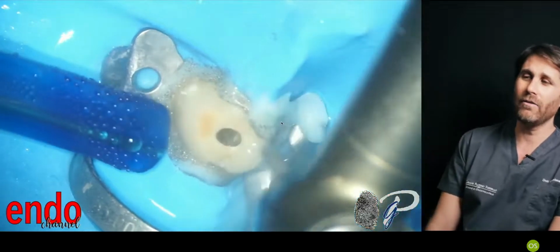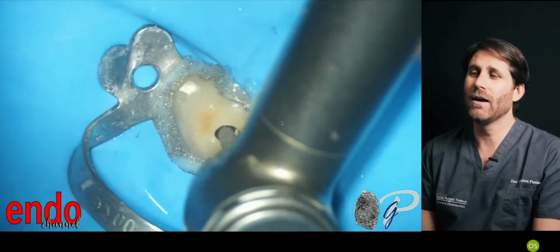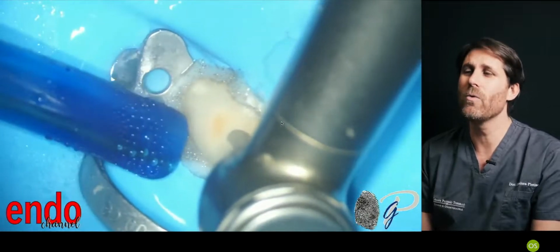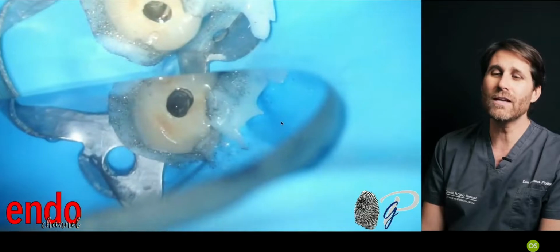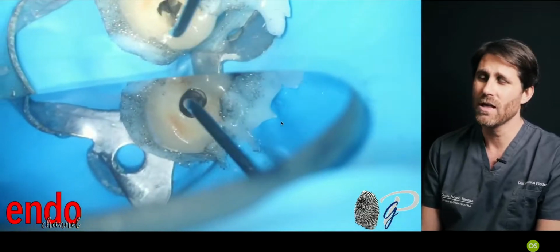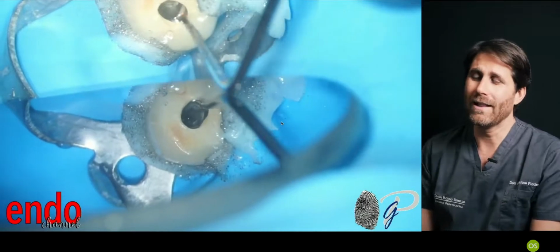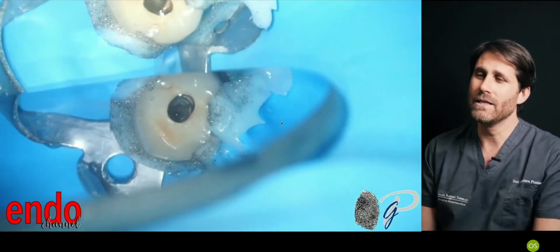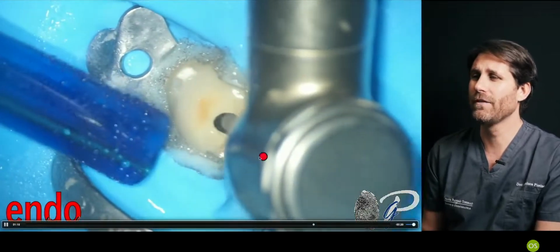In this case, it was a vital tooth under a bridge that got pulpitis, so we needed to perform the endodontic treatment through the bridge. That is something that I'm not used to performing so much. But in this case, the bridge was very well done, and the canal was easy, and we performed this trying to do it in the most conservative way.